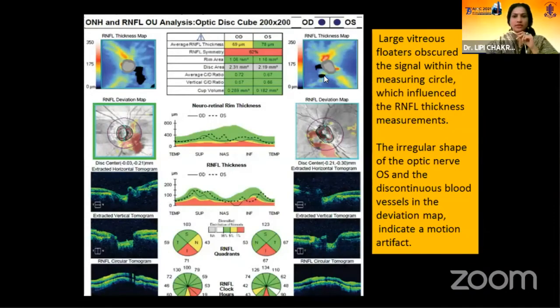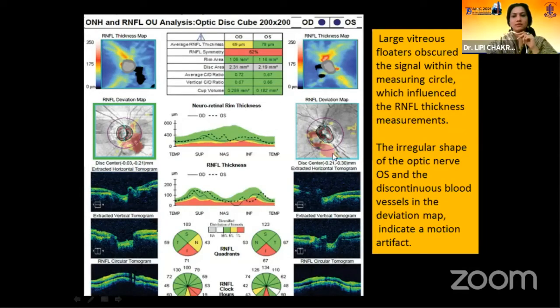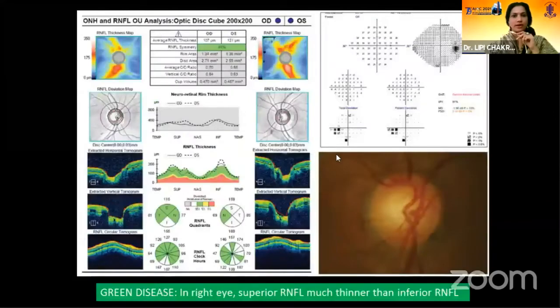Large vitreous floaters in the left eye — these two vitreous floaters are obscuring the signal within the measuring circle and influencing the RNFL thickness. Also note the irregular shape of the optic nerve in the left eye, which is not present in the right eye, along with a segmentation error — the blood vessels are discontinuous, which indicates a motion artifact where the patient has moved his or her eye.